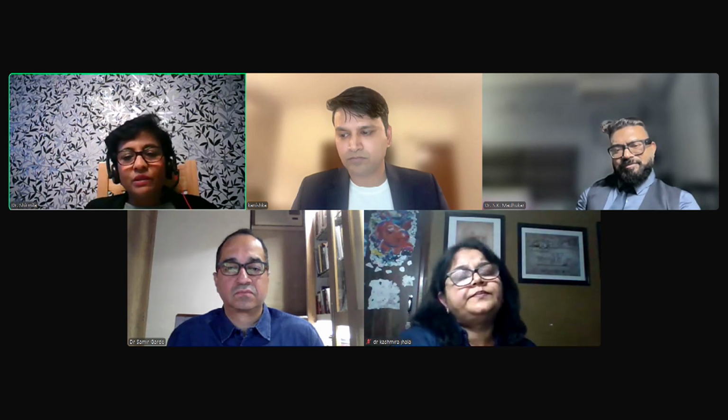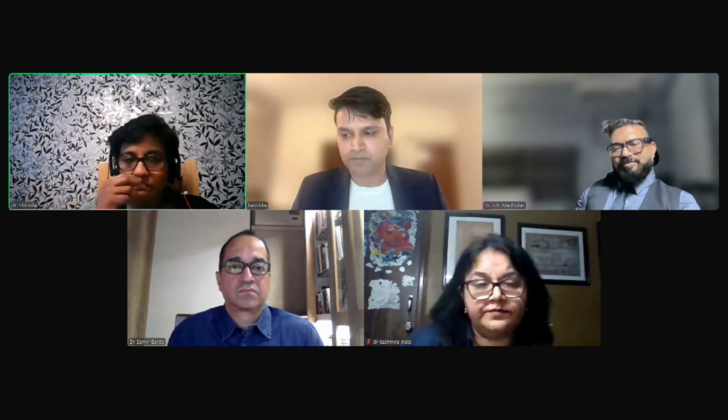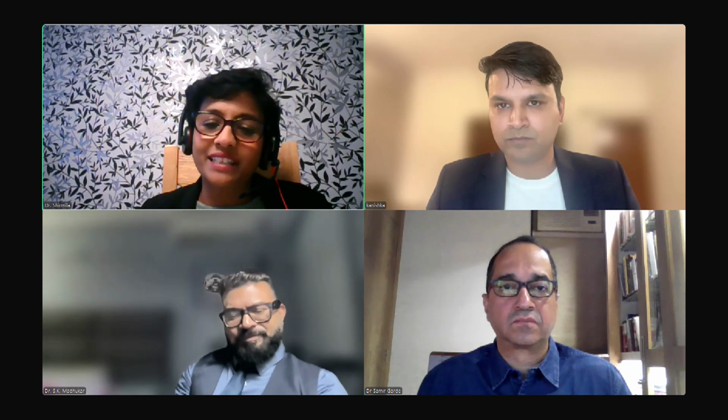We tend to do it in the community. I think I spoke to you about telemonitoring. With our telemonitoring machines, you can remotely increase the pressures over time. The patient doesn't have to come back to the center. So the way we do it in the UK is slightly different, but the way you do the diagnostics, you can decide depending on what resources are available to you.